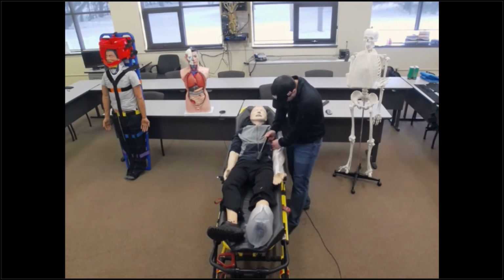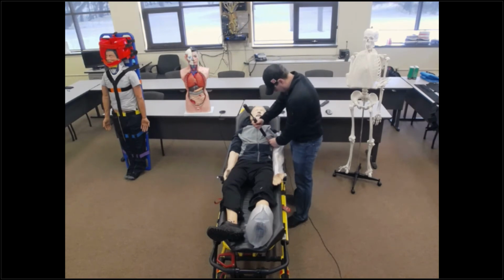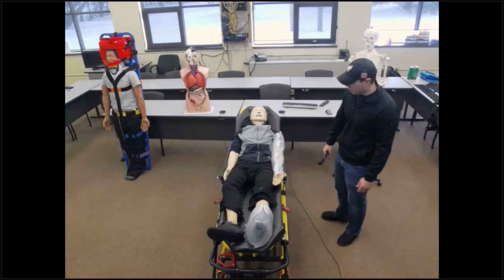Make sure that you get a good seal with that. Put enough air in there in order to stabilize that specific extremity.